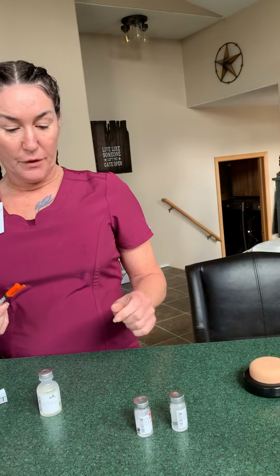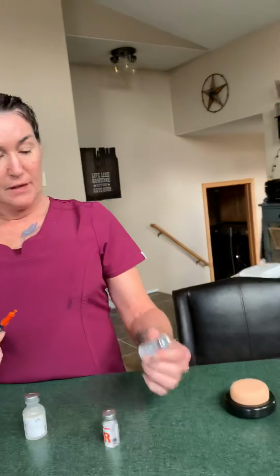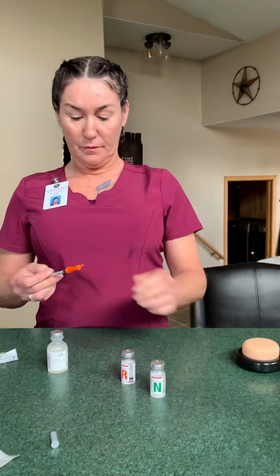With our insulin, we have orders for 12 of the regular and 16 of the NPH.